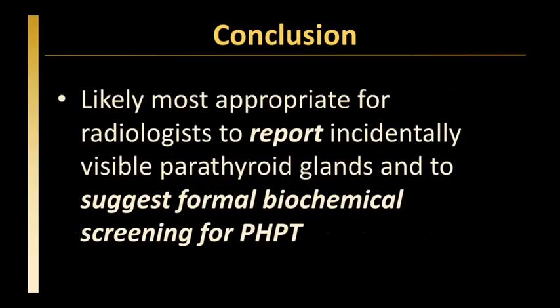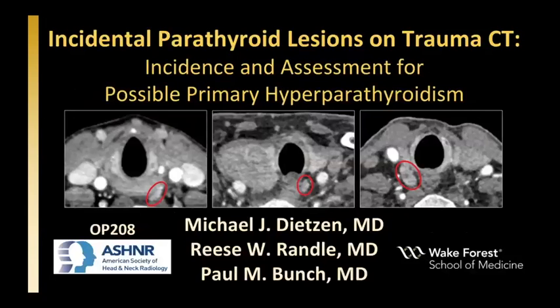Based on the data we have presented to you, we conclude that it is likely most appropriate for radiologists to report parathyroid glands incidentally visible on CT performed for trauma or other reasons, and to suggest formal biochemical screening for possible primary hyperparathyroidism. Thank you for your attention.